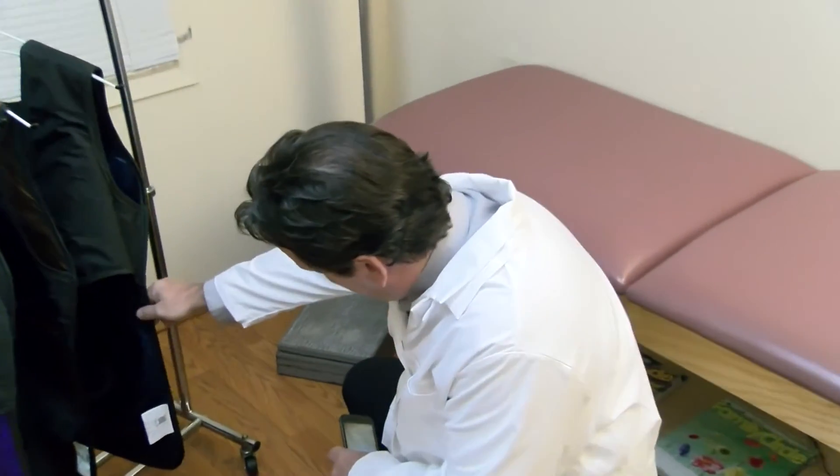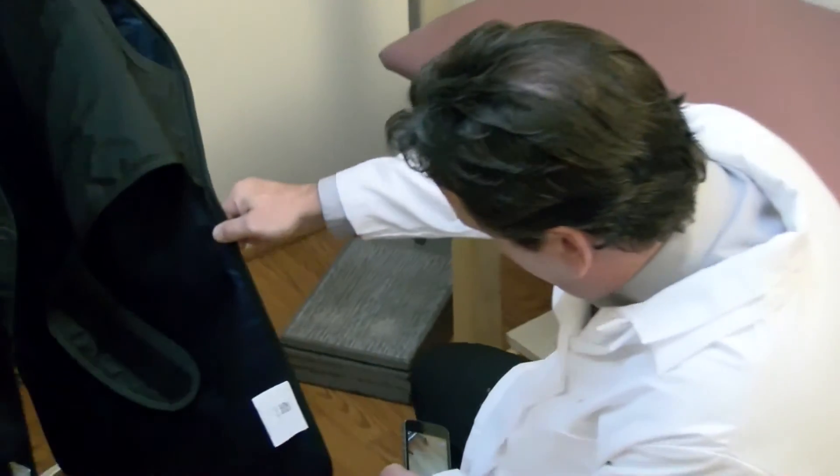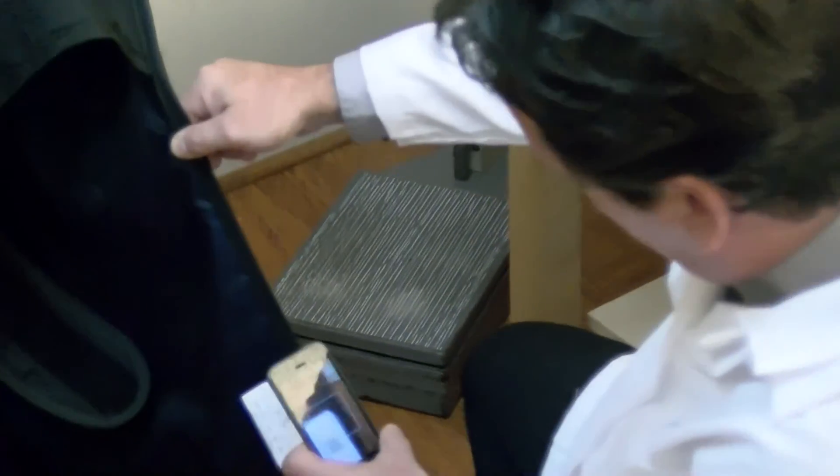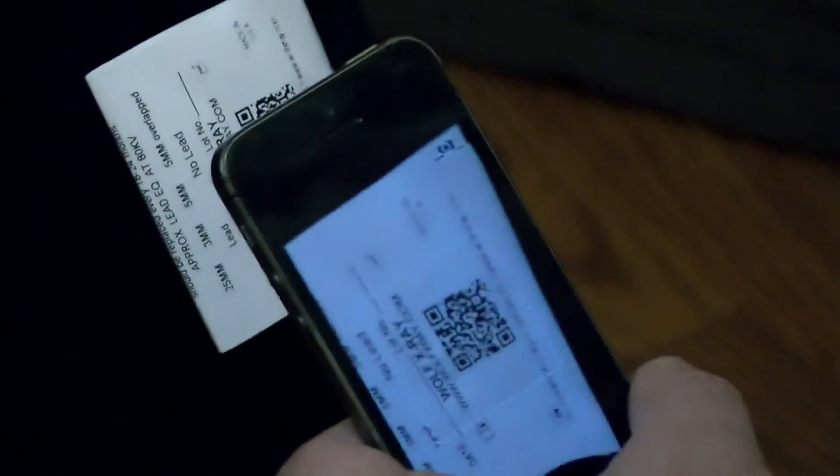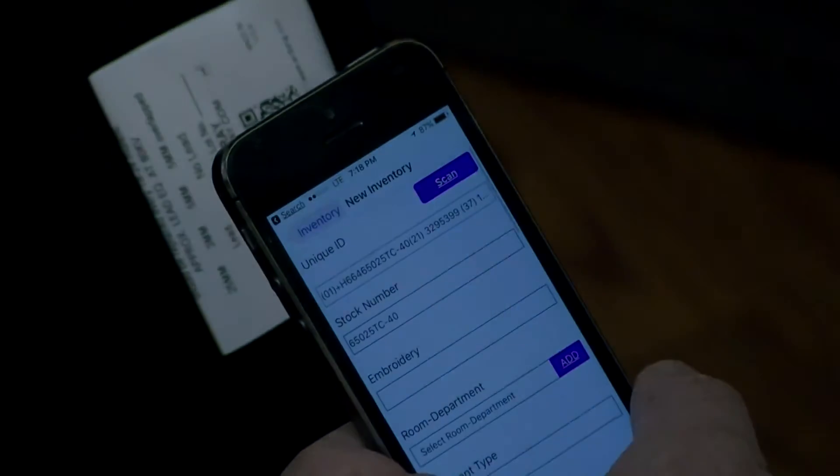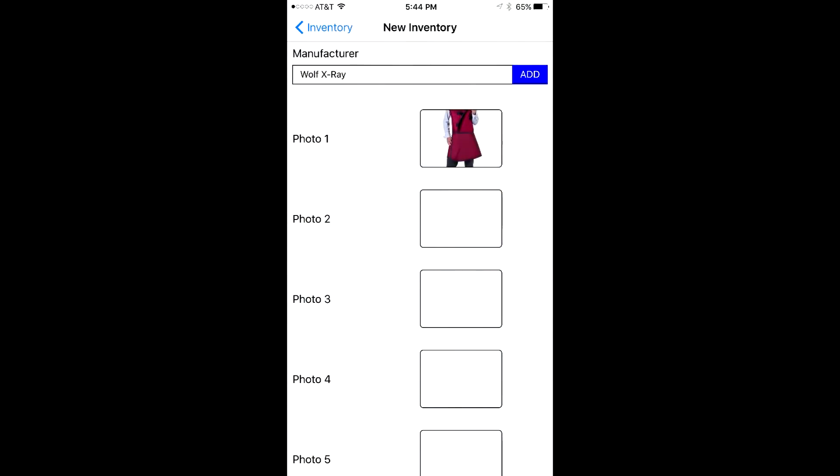From here, you can easily scan a QR code on the tag of the apron to get its details. In addition, you can take several photos of your apron to store along with the apron's information. It's that easy.